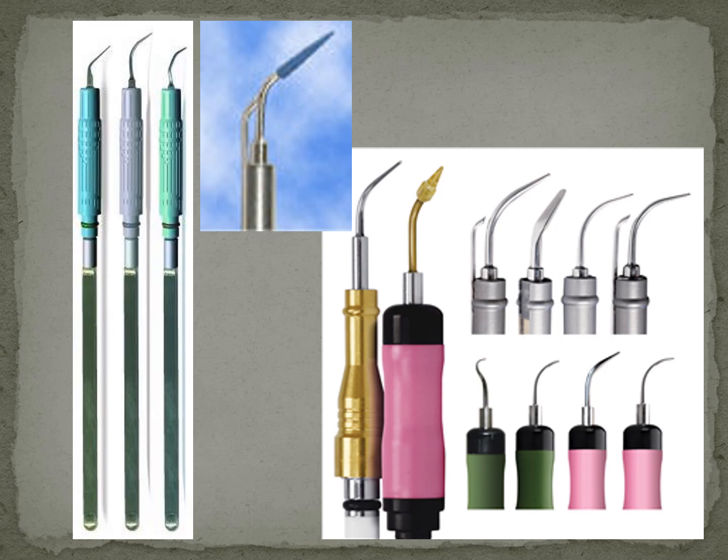There's also tips for implants. There's all kinds of different tips, and we'll look at some different ones. I've picked 3 for your kit, and those are pretty universal ones, and those are the ones that you will use in clinic. And there's also ones for supracalculus. There's also ones for subcalculus, and they're basically just designed for the area that we want to use them in.